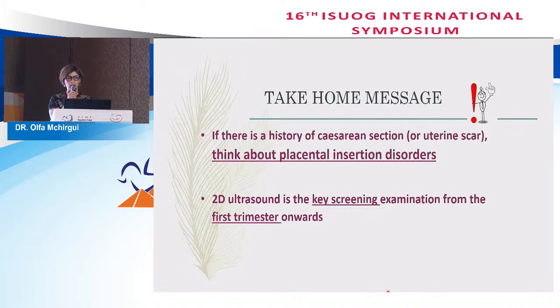So the take-home message: if there is a history of cesarean section or uterine scar, think about placental accreta spectrum disorders. 2D ultrasound is the key screening examination from the first trimester onwards. And thank you for giving me this opportunity.